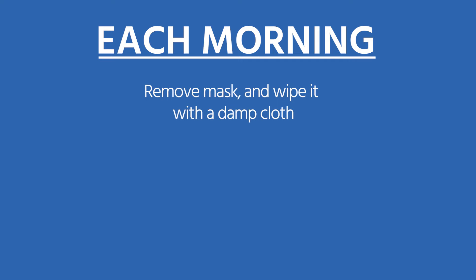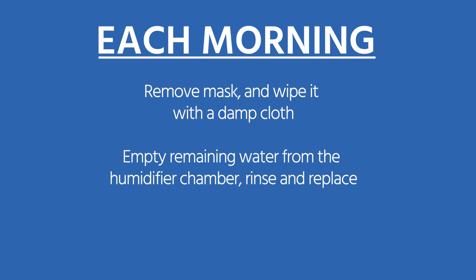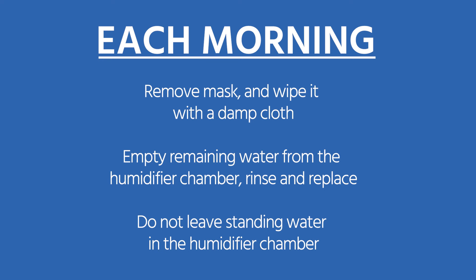It's important to schedule a regular time to clean your equipment so that it becomes part of your normal routine. Each morning, remove the mask and wipe it with a damp cloth. Empty the remaining water from the humidifier chamber, then rinse it out and place it back into the unit. It is very important to not leave standing water in the humidifier chamber, as this can cause bacteria to grow inside of the chamber.